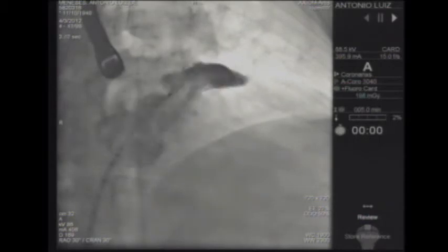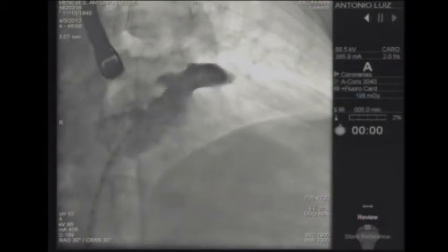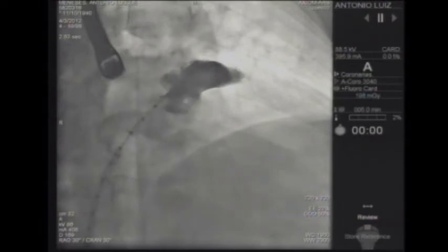projection, which is much better. I just changed the projection slightly. I went RAO 30. I kept cranial 30, and I went more RAO. So I think this projection is better. It shows the landing zone, and you can see the neck.